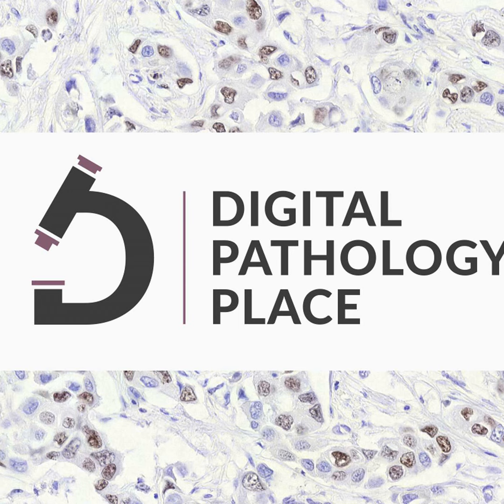And that's where you, for example, sometimes see stupid false positives that a pathologist can easily discard because they know, okay, this group of epithelial cells is probably just a fragment that is appearing there because of surgical artifacts instead of being an actual metastasis. And if you would have global context, a neural network could also learn that. But that's also true for supervised learning. If you only have patches, that's something you cannot learn.